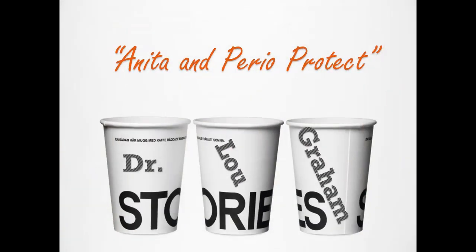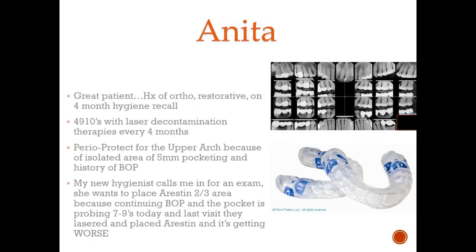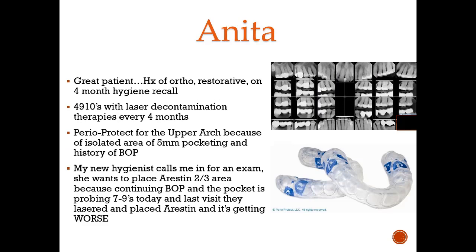Anita and PerioProtect. This was a great case. So she's a great patient. She shows up for 4-month recalls all the time, always doing laser decontamination. Not active treatment, just decontamination with lasers every 4 months. And we started using PerioProtect in her upper arch because she was breaking down in a couple areas.